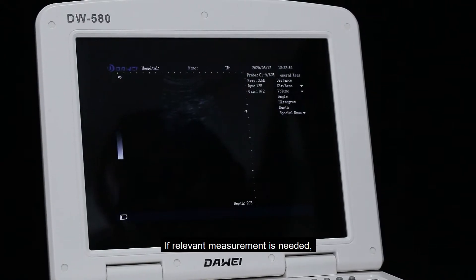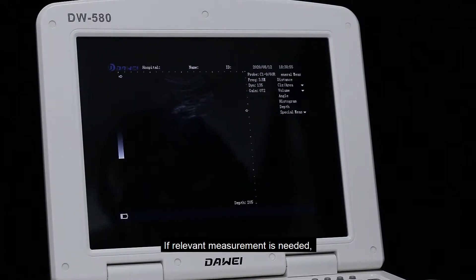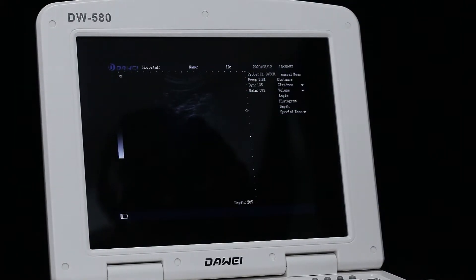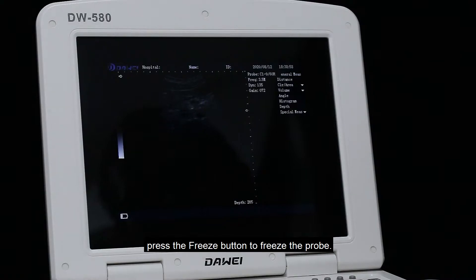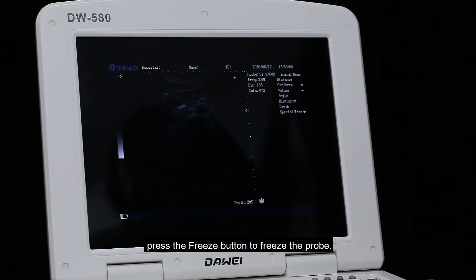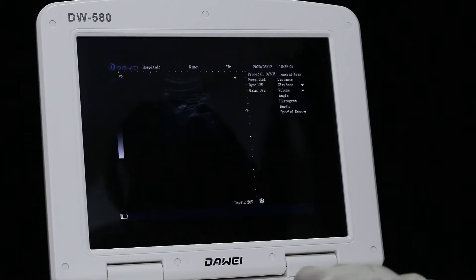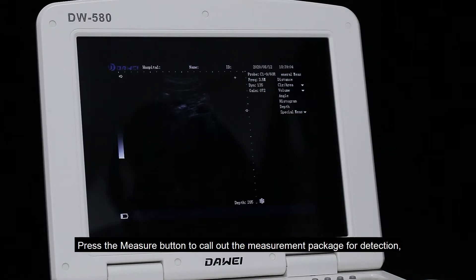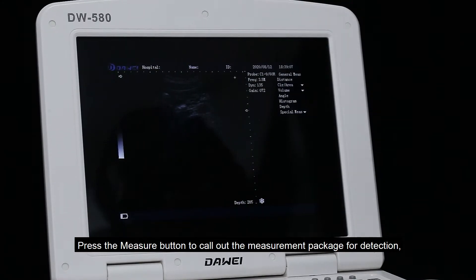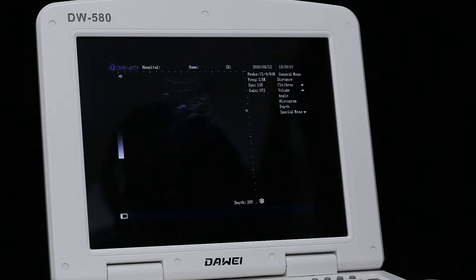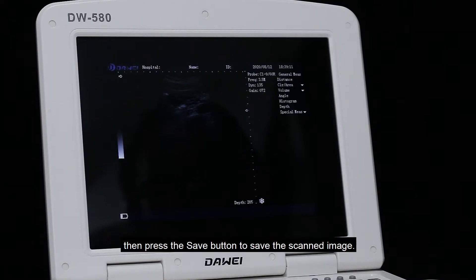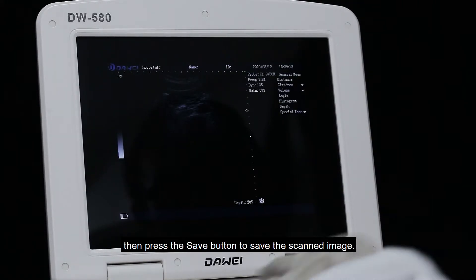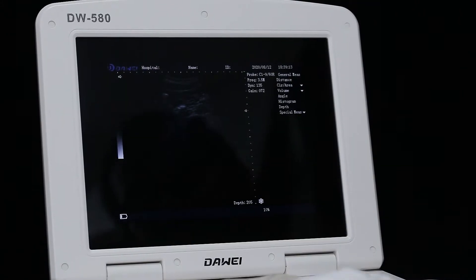If relevant measurement is needed, press the freeze button to freeze the probe. Press the measure button to call out the measurement package for detection. Then press the save button to save the scanned image.